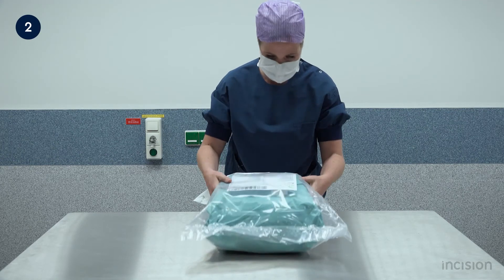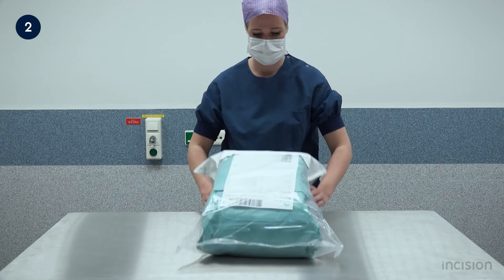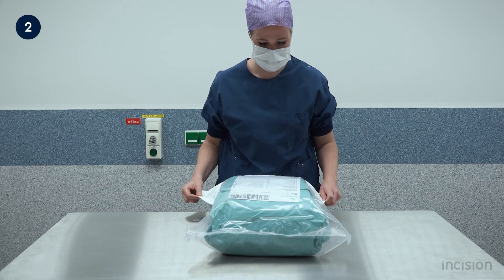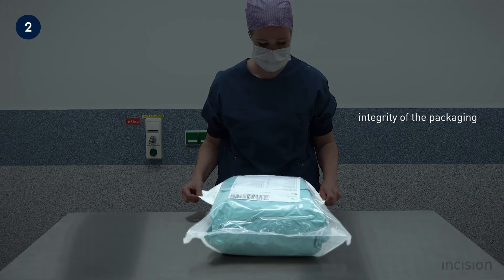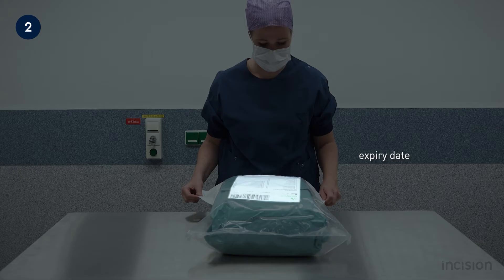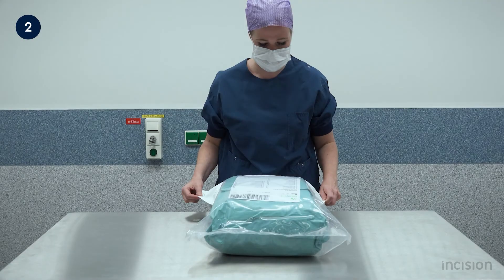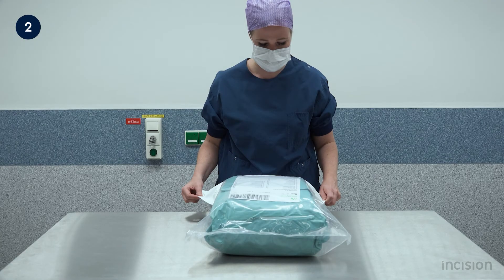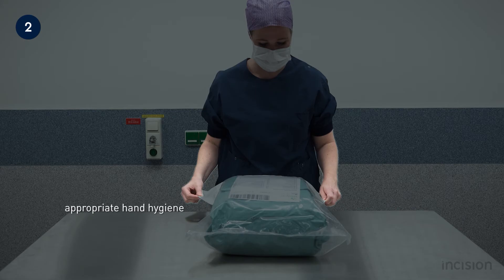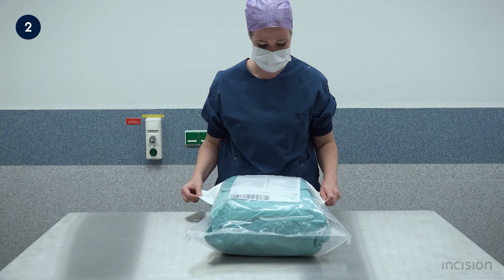Prior to opening any sterile item, it should be checked to ensure that it is indeed sterile and safe for use. Also of importance is that the scrub nurse handling the sterile items should have performed hand hygiene according to local protocol and also put on appropriate surgical attire, including a surgical mask.